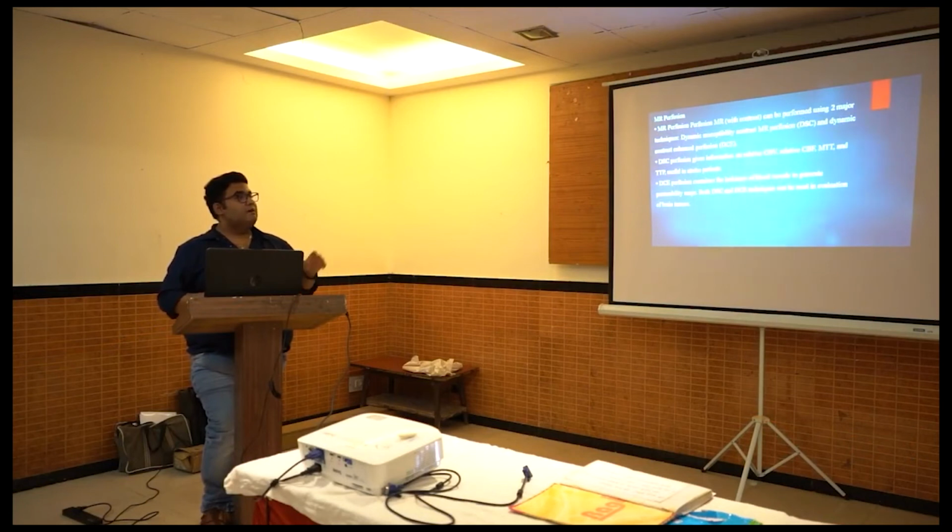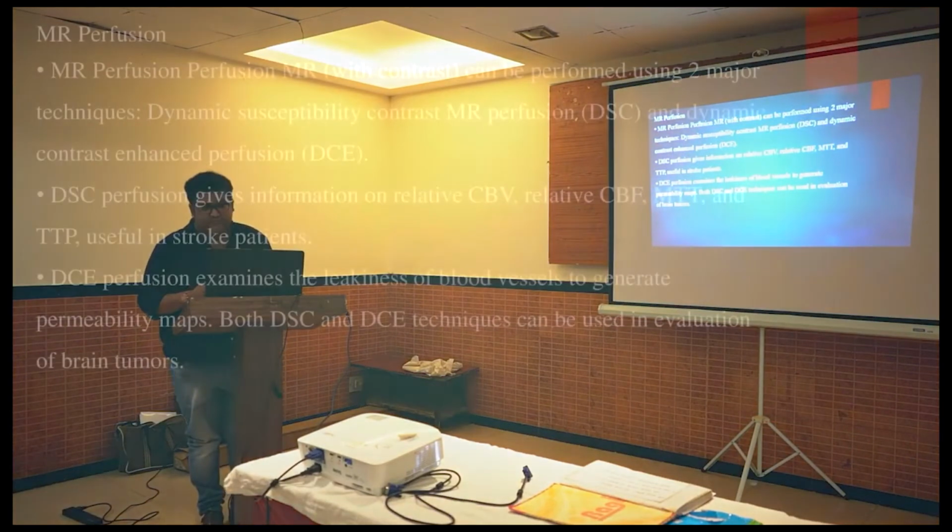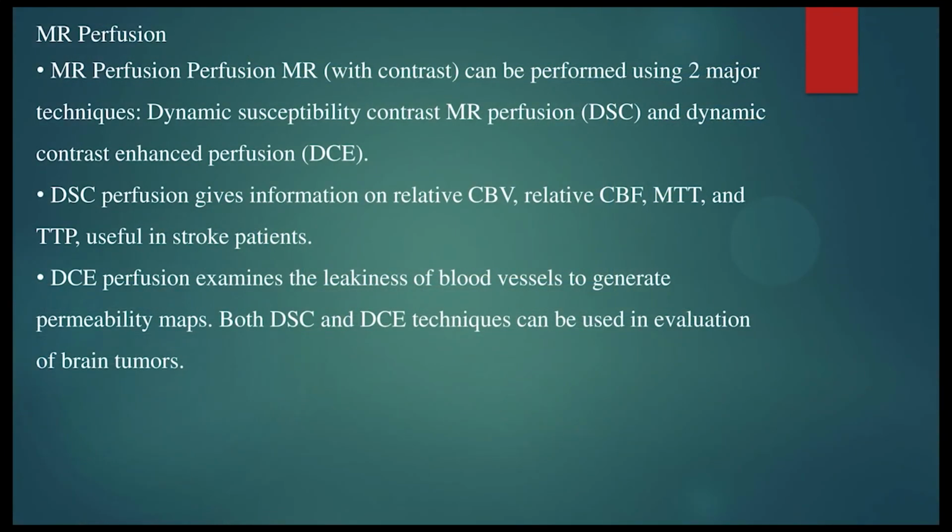We are talking about MR perfusion. At the place where I have worked, we had something called a stroke protocol. When a patient used to come with clinical symptoms of a stroke, we had code blue. Code blue means the patient came to the emergency and will be taken to the CT room. A CT will be done, and if there is no hemorrhage and if there is some hypodensity, the patient will be put in MRI. FLAIR will be done because we have 4 hours to salvage the brain.